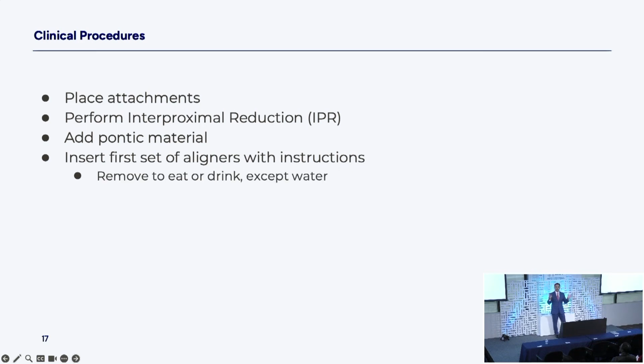Well, you're going to wear these all the time except for eating and drinking, except water. You can leave them on for water. So very simple. Your patient's going to wear these all day and night except for eating and drinking. You take them out for that.